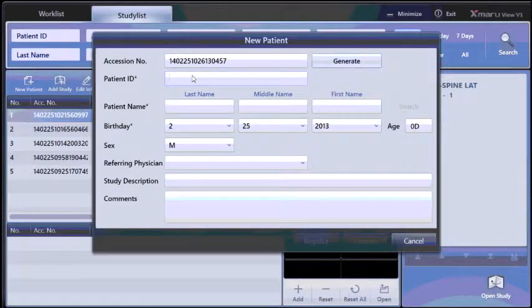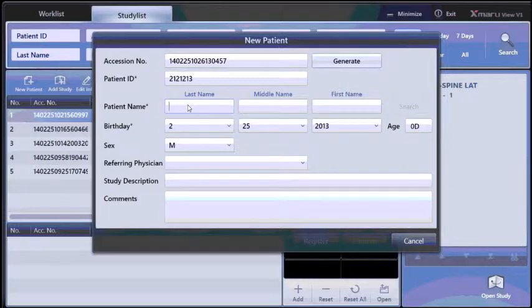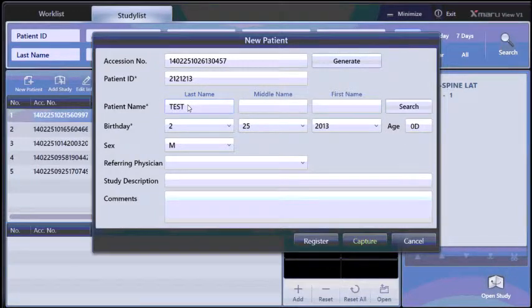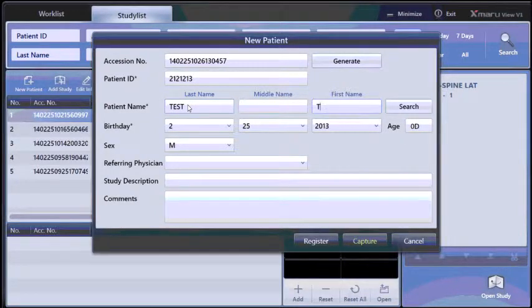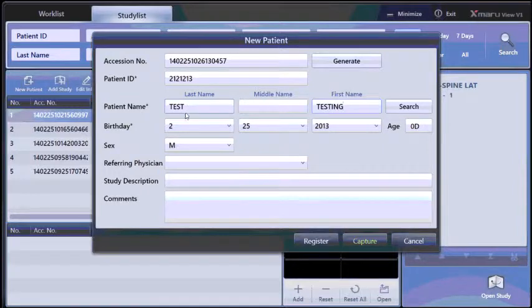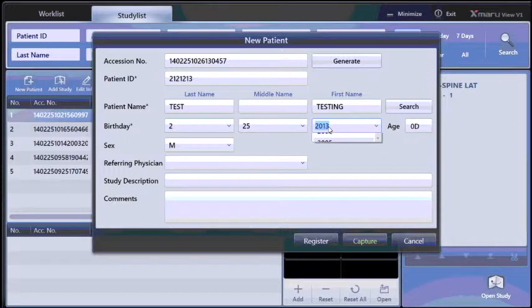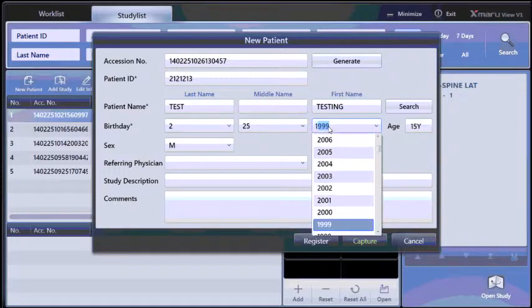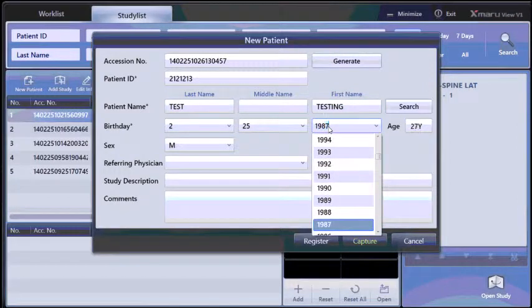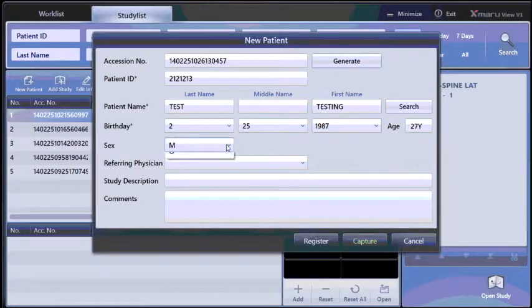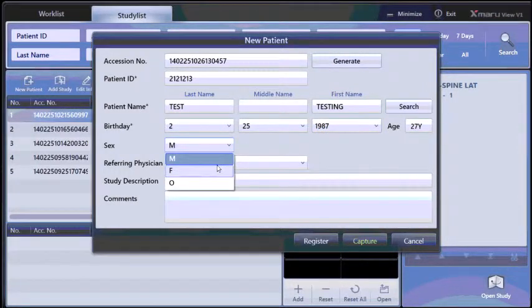Enter the patient ID, enter the patient last name, first name, and birthday. Choose male or female.